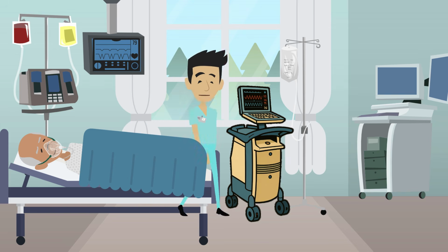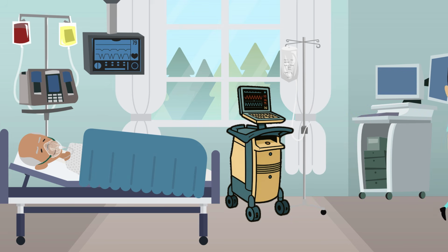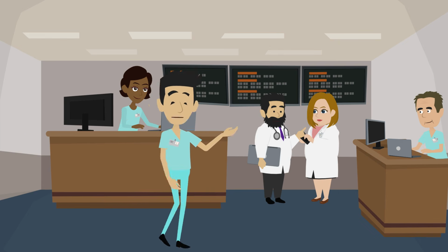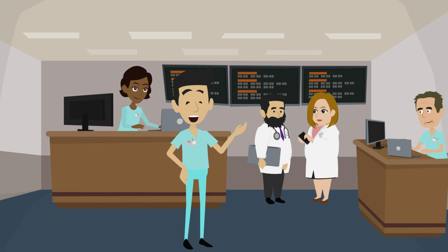Let's wrap this up. As we learned, gas loss can occur due to catheter perforation, loose connections, or high rate of diffusion. Now that you know why this alarm occurs, you will know how to troubleshoot it. Hope this helps make you feel more confident in caring for patients with IABP therapy when the gas loss in IAB circuit alarm is activated.